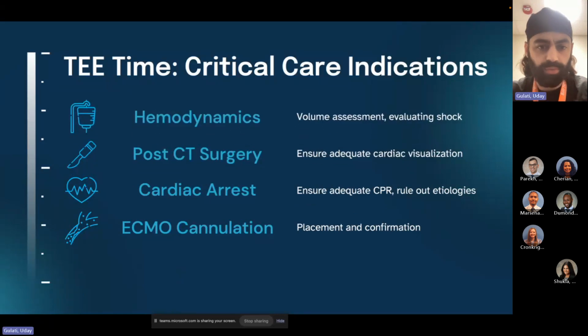And so, this kind of goes along with resuscitation, right? Just with anything that we do in the ICU, we've already gone through in separate lectures how crucial volume assessment and hemodynamic assessment can be in evaluating our patients with shock, in deciding things like fluids, where the source of the shock is coming from, even if it's multifactorial, being able to better delineate what we want our next intervention to be or to guide our practice in real time, giving us one more assessment. But in a lot of our patients, those views are difficult.